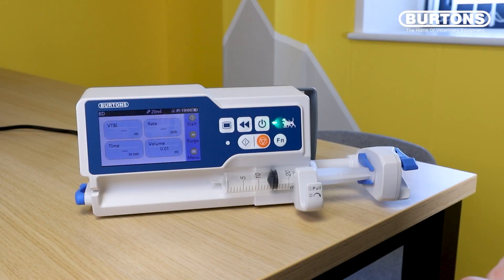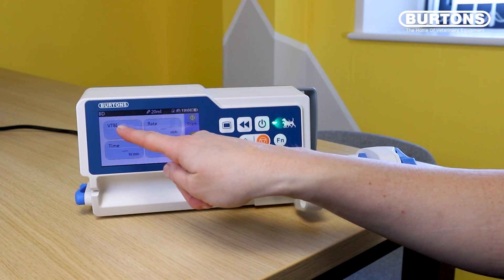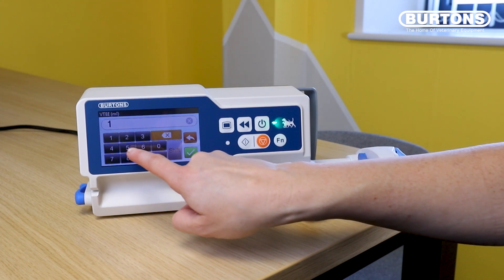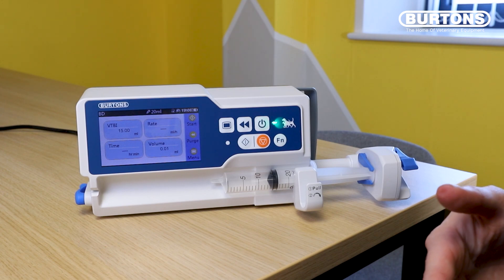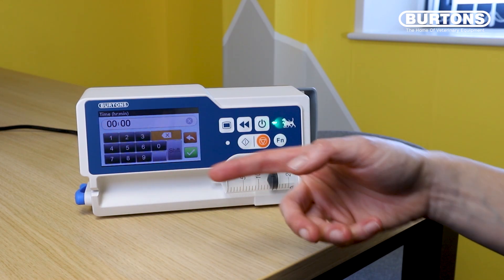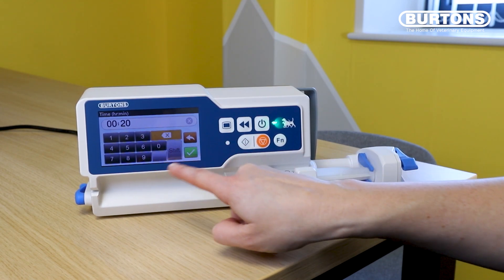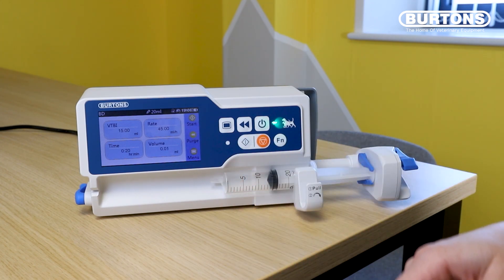Now if we want to start our CRI or our bolus of drug we can do so by selecting VTBI, so volume to be infused. I've got 15 mils in my syringe so I just need to go 15, and then if for example I want this drug to be administered over 20 minutes I can go down to time — hour hour minute minute — so over 20 minutes I can put double zero 20, and that means it's going to deliver this drug at a rate of 45 mil an hour. All we need to do from here is just start the CRI.